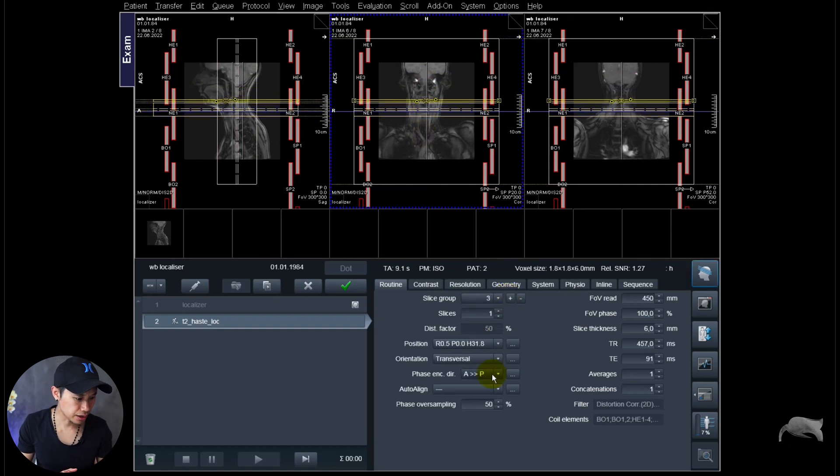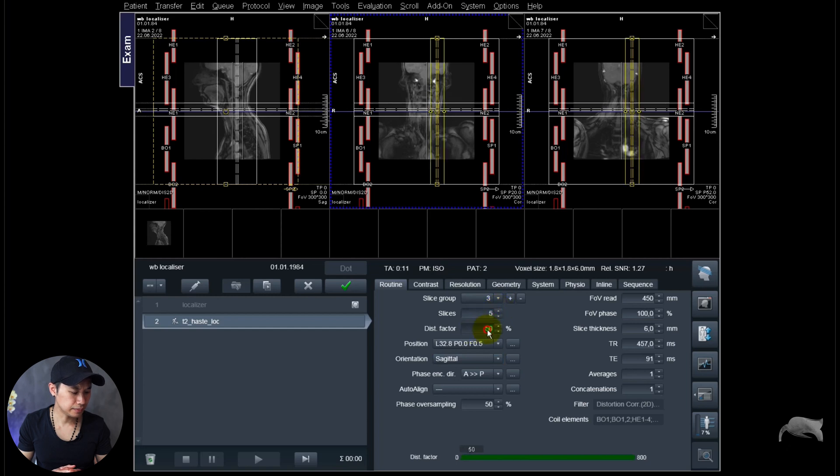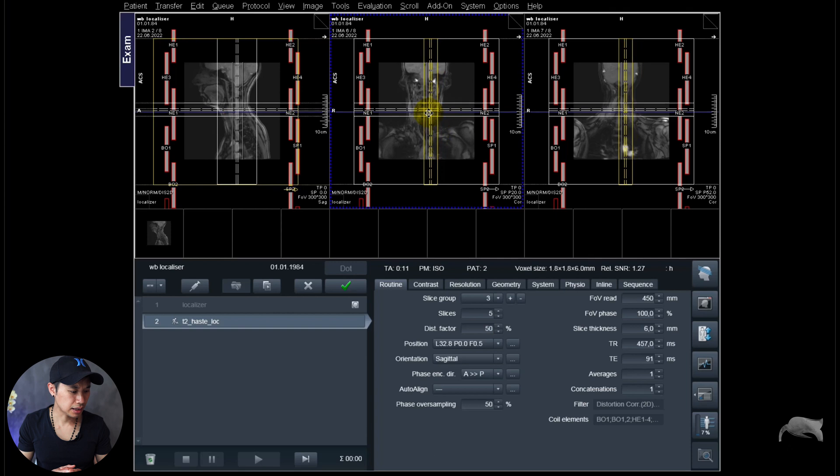And we are missing one plane which is sagittal. So we're going to create a sagittal right here. Now add a little bit slices and distance factor as well here, like that.